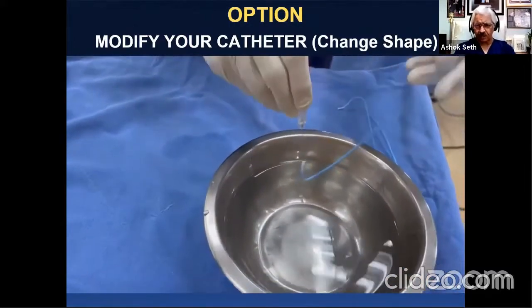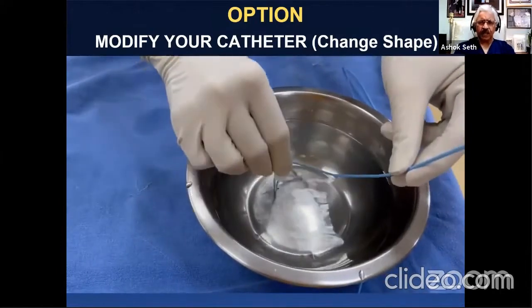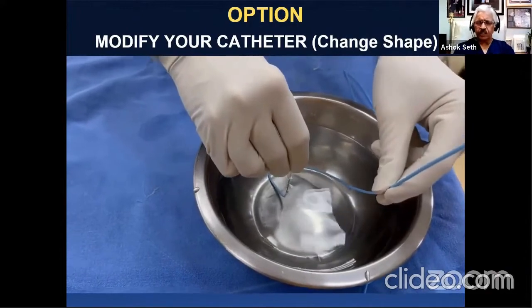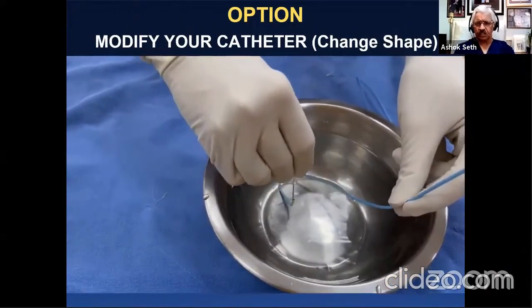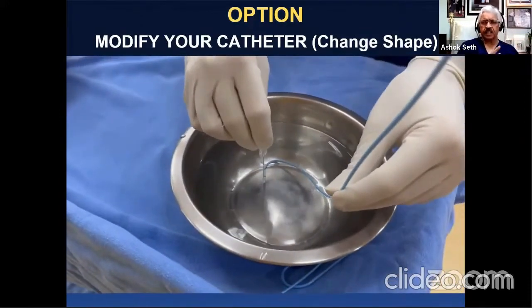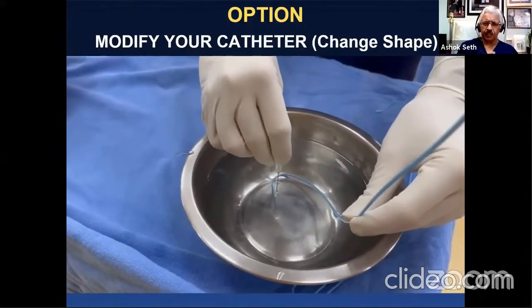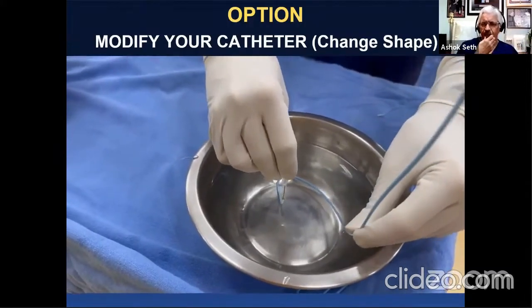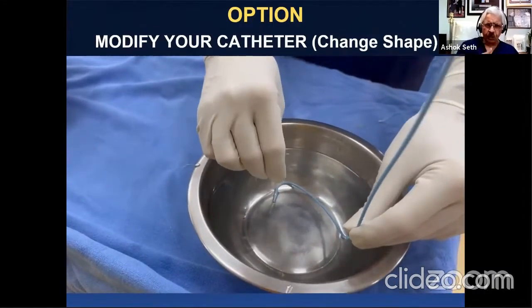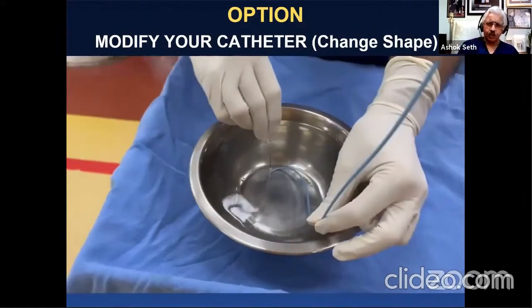Now, this is extremely hot water. This is recently boiled water, which has been put into this. And I've now just dipped it in for 30 seconds. When you dip it in for 30 seconds, it becomes softer and takes the shape of the wire introducer, which you have actually created to a fresh shape with the primary bend pointing anteriorly, also giving a special curve. And now I've just transferred that into ice cold water.